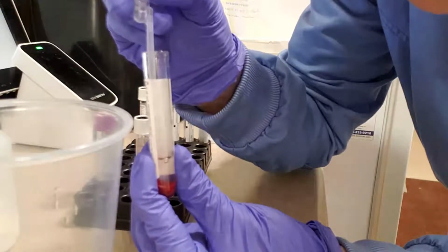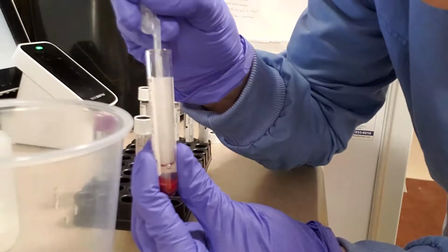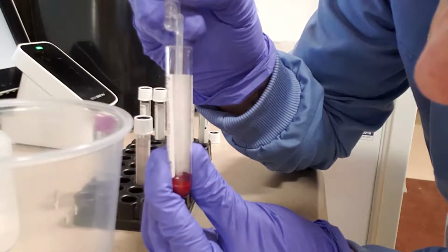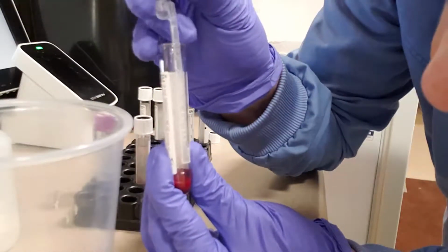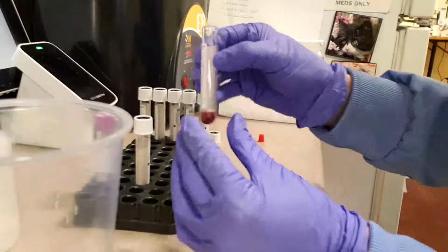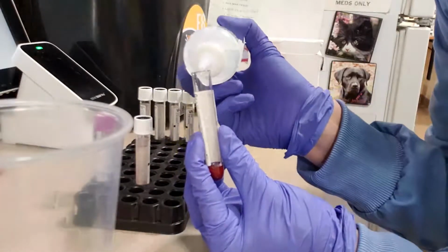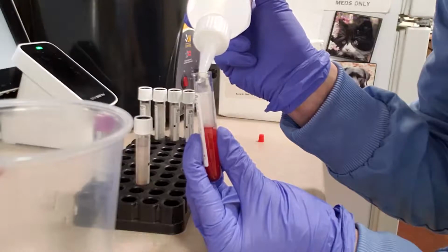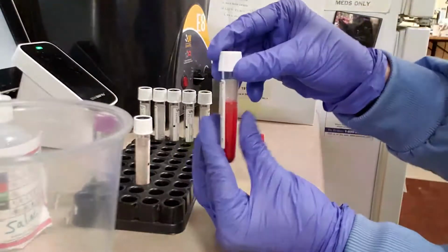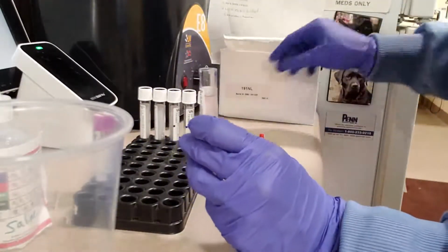Okay, getting a bit closer now. Okay, so again, we just want to get the rest of that saline. Do one more. There we go. We'll discard that. And then we're going to do the same thing again. We're going to add our fresh saline. We want to put it to about 3/4 of the way full. Put our top back on there, and then we'll put it in our centrifuge. And we'll also do our recipient one, so that way they can balance each other out.